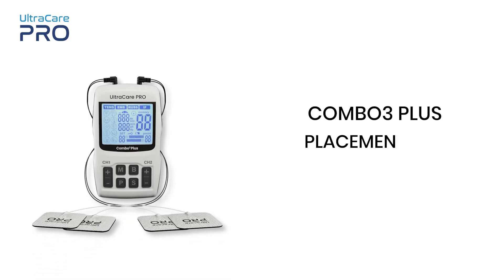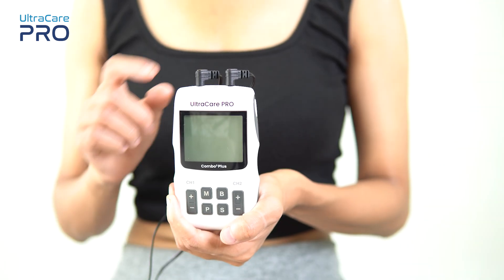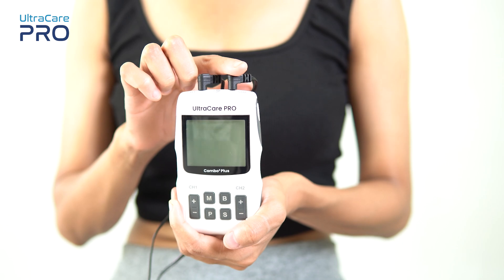In this video we are going to have a look at the electrode placement of the Combo 3 Plus device by Ultra Care Pro. Wires attached to the electrodes come from channel 1 and channel 2 of this device.